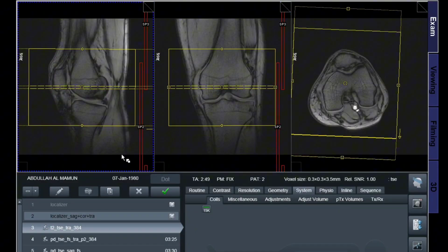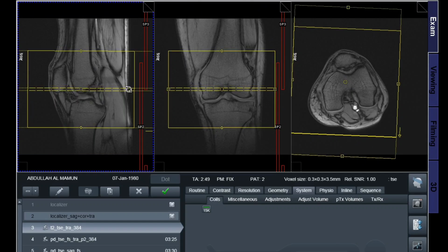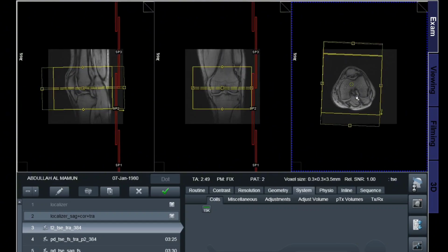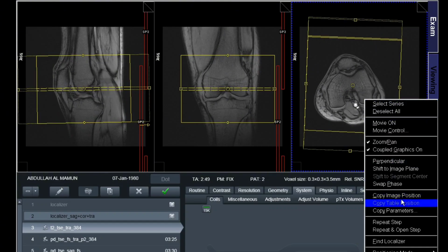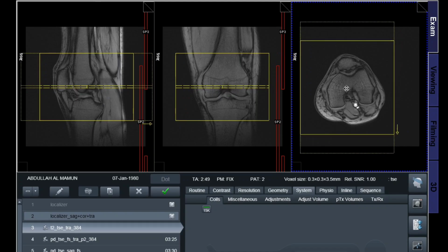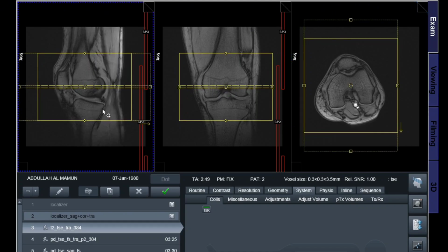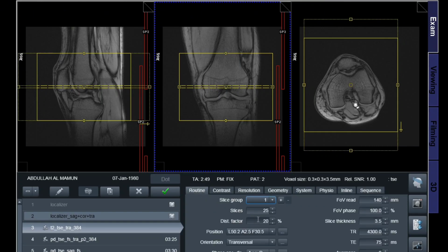In today's video, we will discuss MRI left knee, also written as MRI LT knee. This video will cover what MRI left knee is, why it is done, which structures of the knee are evaluated, the procedure of MRI, conditions detected by MRI, and what an MRI left knee report usually shows. So, let's begin. What is MRI left knee?